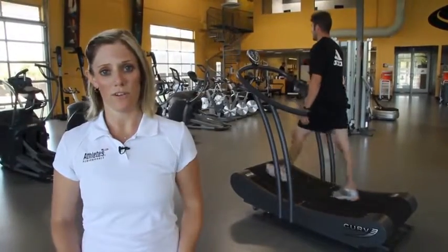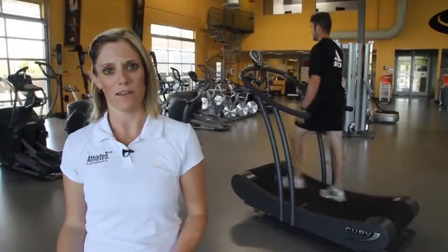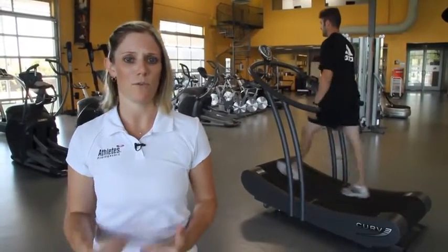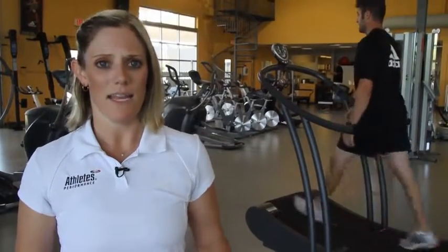It's very useful to use the curve not just for running or return to running or cardiovascular conditioning, but it's also been a really good tool for patients coming post-op with normalizing their gait asymmetries and helping them return to a more normal gait function for basic activities of daily living, or ADLs.